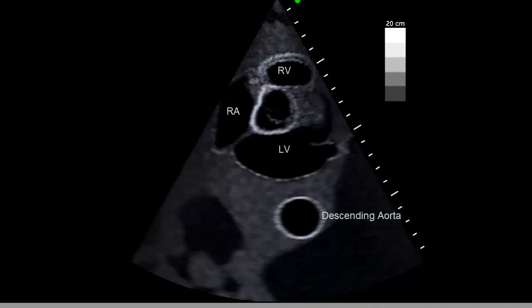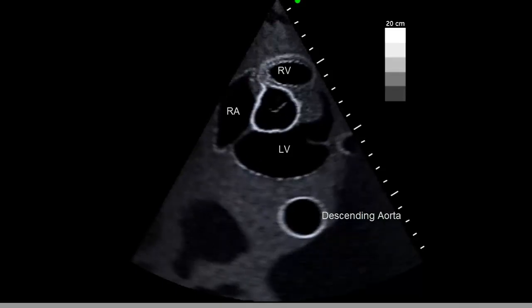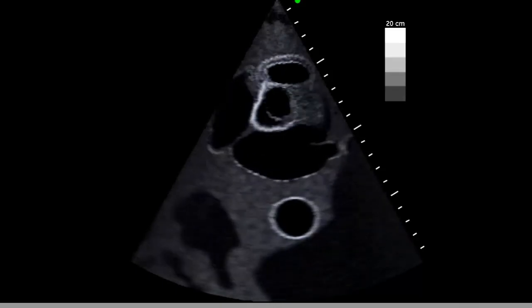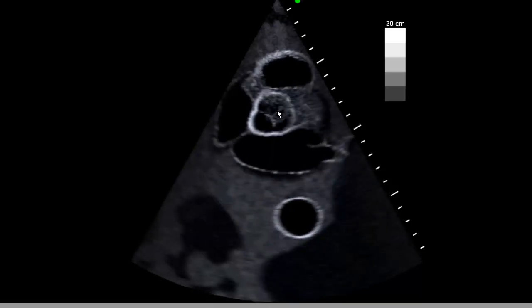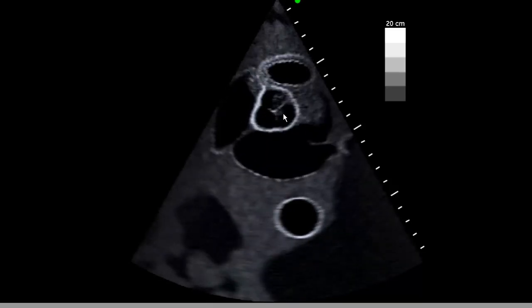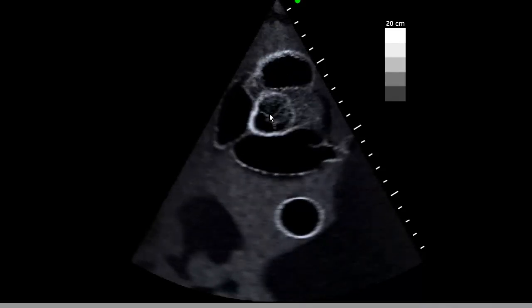Now, I'm going to play a few seconds of video in slow motion so you can see the pathological bicuspid valve open and close. You can see here where it doesn't shut. This is just one, two leaflets that are closing, and this area never actually gets sealed off to prevent regurgitation into the left ventricle.